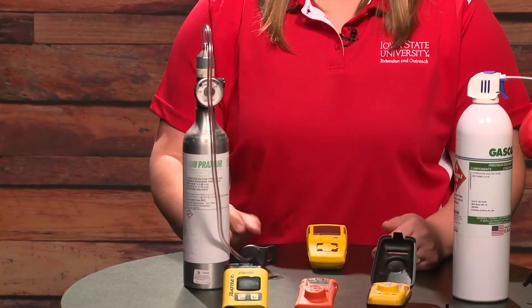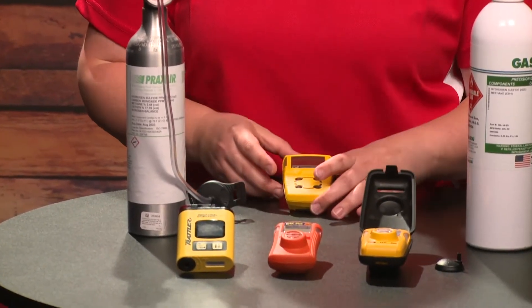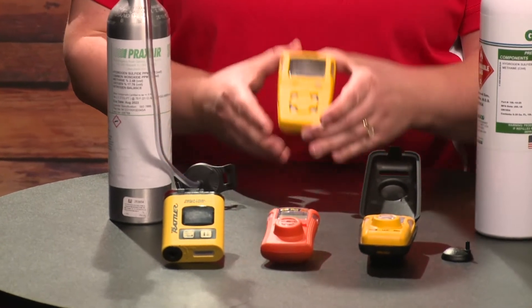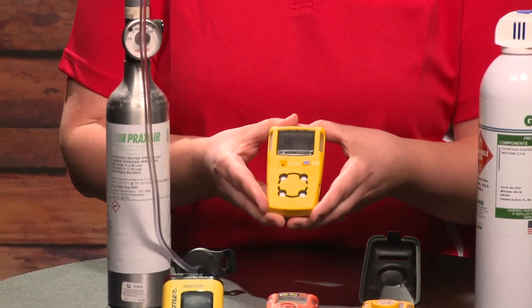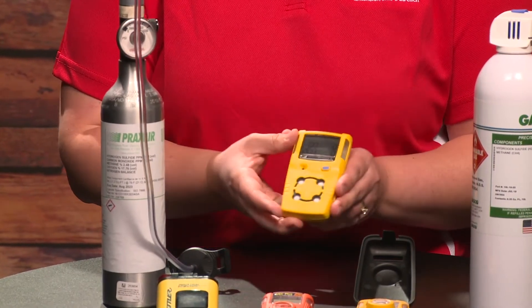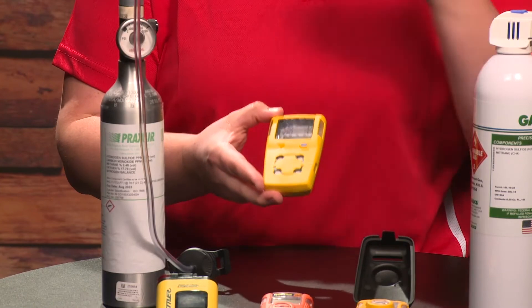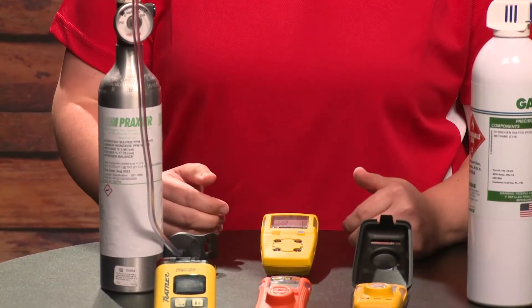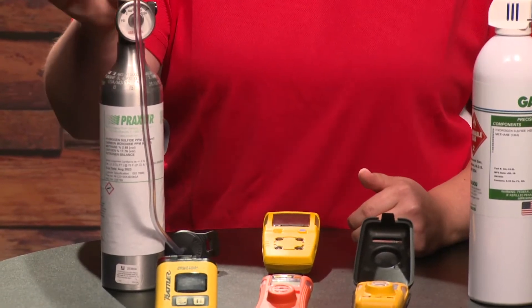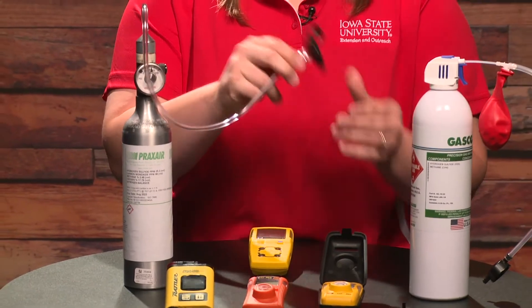There are a few different gas monitors here, and these will work with all of them to test the hydrogen sulfide. The one I'm going to use is a four-gas monitor. I've got it turned on and ready to go — it takes a little bit to wake itself up and calibrate. I've got my gas, the regulator, and the tubing, and it's already connected to the calibration cap.